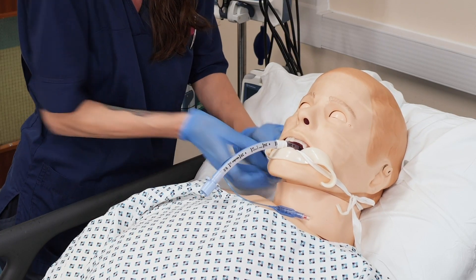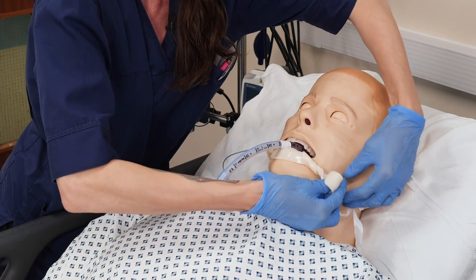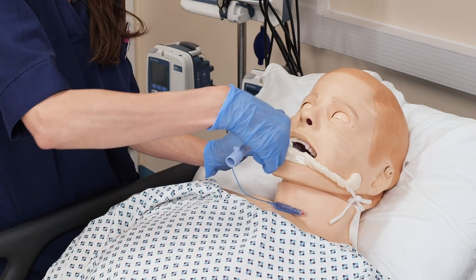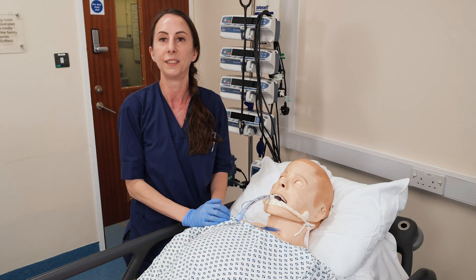Once you've done one side, obviously do the other side. You can use a longer piece just so that it's not touching the skin, and then it's secure and also not causing any pressure damage to the patient. Thank you.